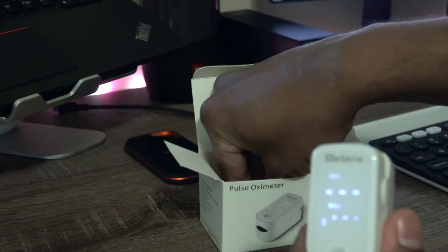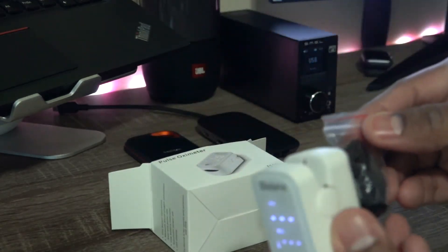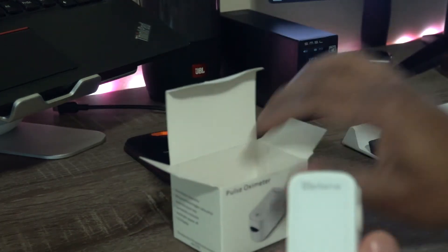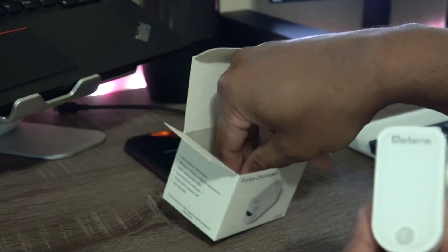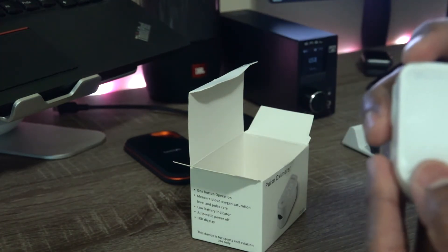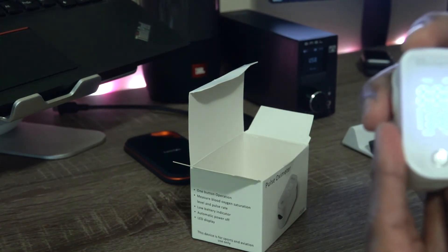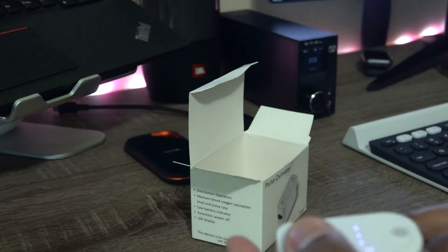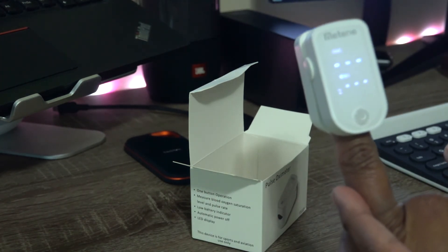It also comes with a small lanyard thread if you want to attach it, though I'm not going to use it. I love this product compared to others available in the market — I definitely recommend it. I've used others and it wasn't even close to this. Thank you guys!